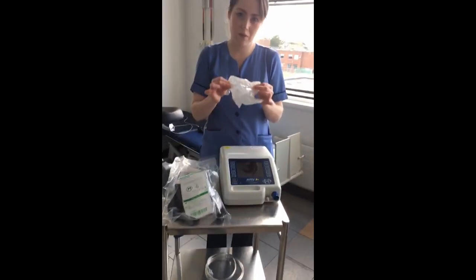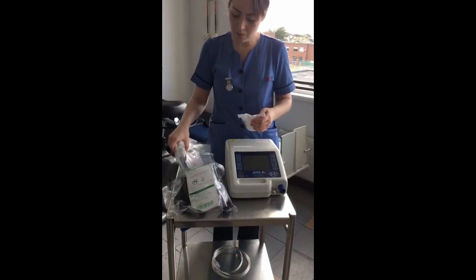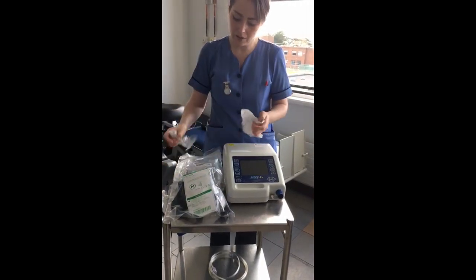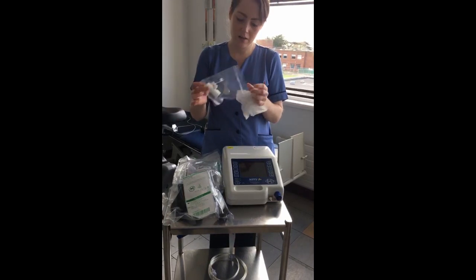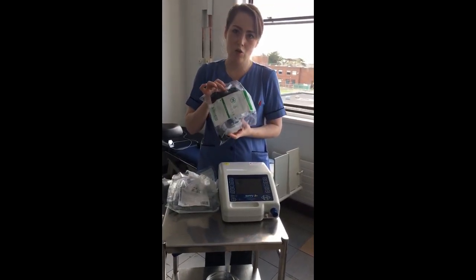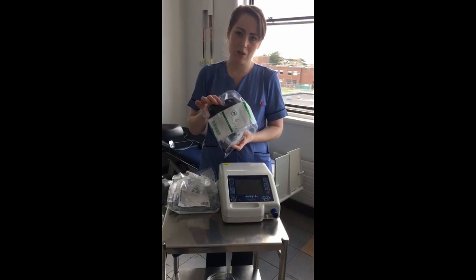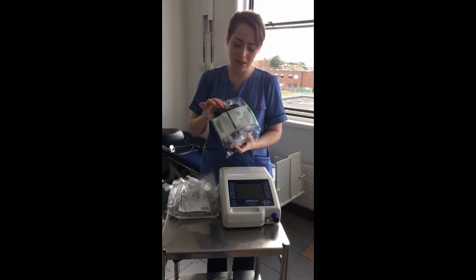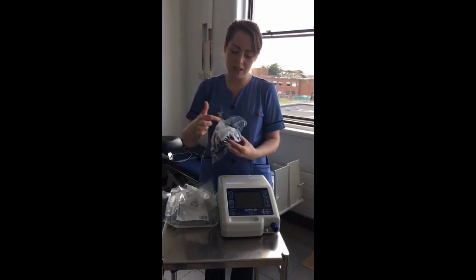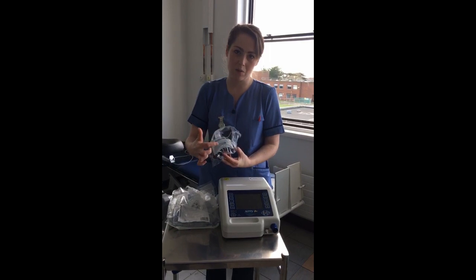We're going to have a filter, tubing which will be clear in colour, an oxygen connection, and a vented grey strapped mask. This vented grey strapped mask comes in small, medium, and large, which you will see on the pack. On the mask itself you'll see the size indicated at the bottom.